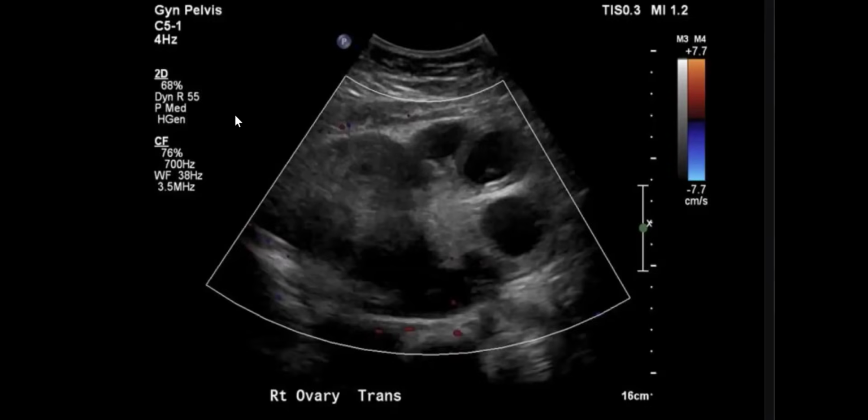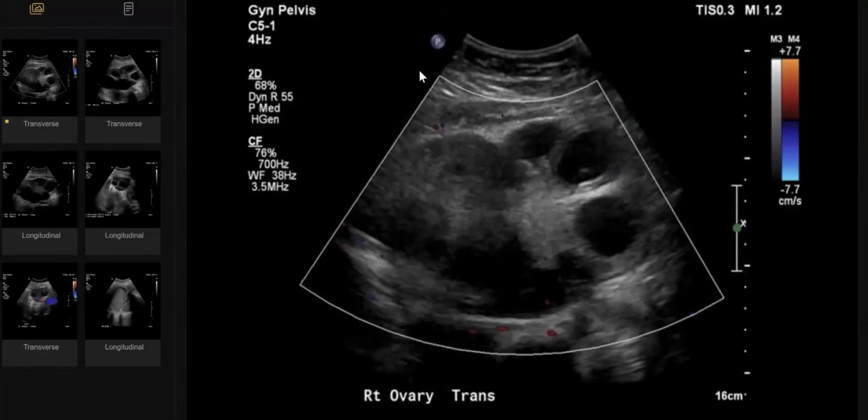Now, an important case also. You can scroll between images. This patient has acute abdominal pain following ovarian stimulation. I am presented with ultrasound images of the right ovary, in which I can see multiple large follicles, and the ovarian stroma is hypoechoic at the periphery. It is dense centrally, but towards the lateral side it is hypoechoic. I wonder if it is a cyst filled with hemorrhage, or the hypoechoic stroma. I would like to see other images.